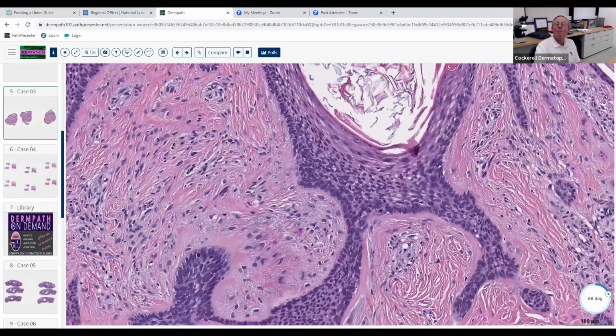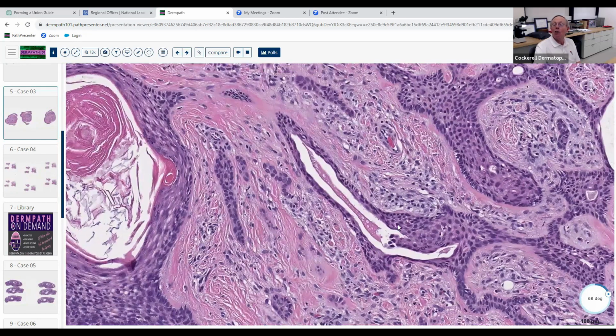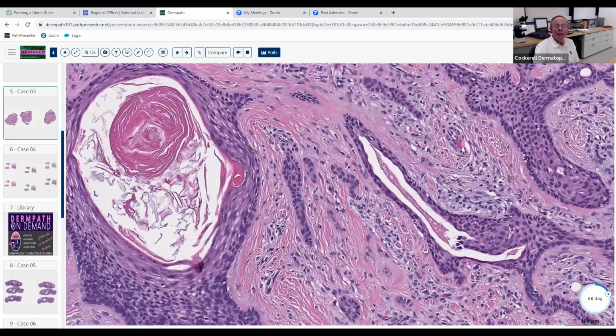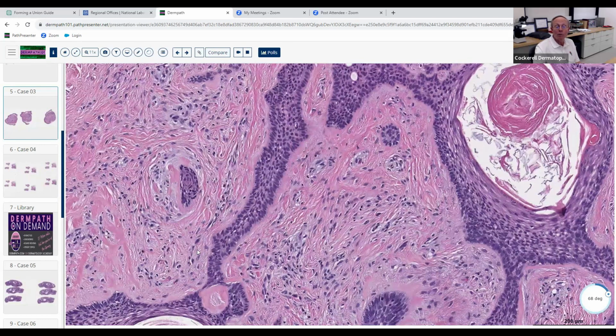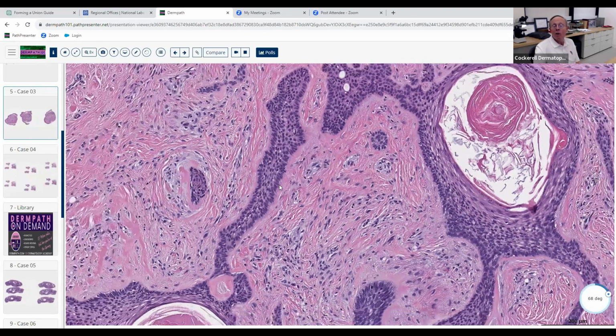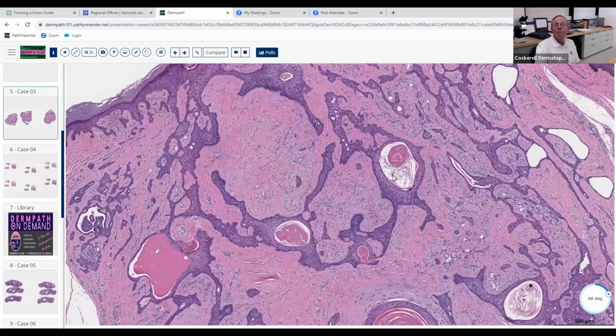Anybody know? Okay, well, you'll know now. Birt-Hogg-Dubé. And those give you trichodiscomas, perifollicular fibromas associated with those lesions. Something like that would be a little perifollicular fibroma. They look like this. They get this prominent stroma surrounding these small strands of follicular epithelium. And they're also mantle zone lesions where they form.